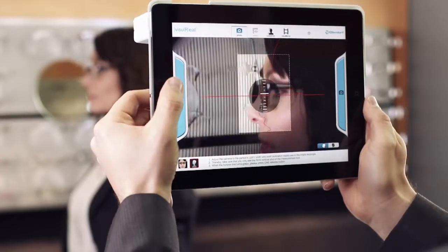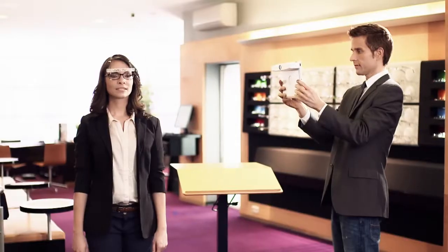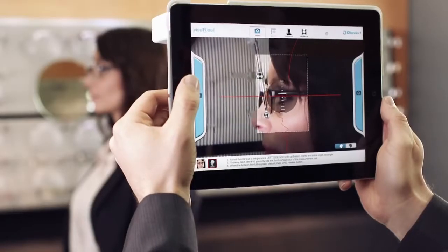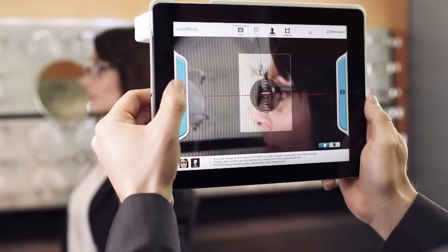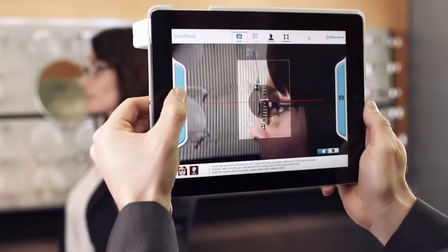Check the natural head and body posture of your patient again. Both calibration marks and the eye have to be in the bright rectangle. The horizon line has to be green.